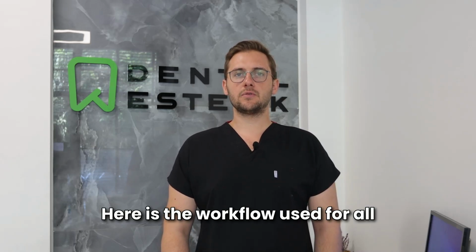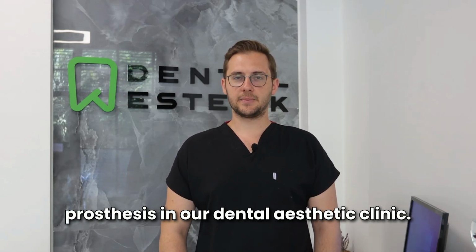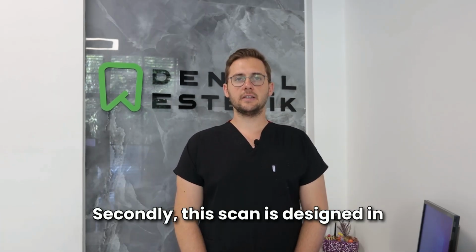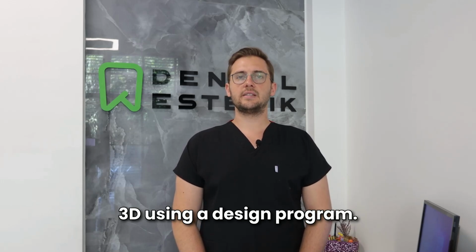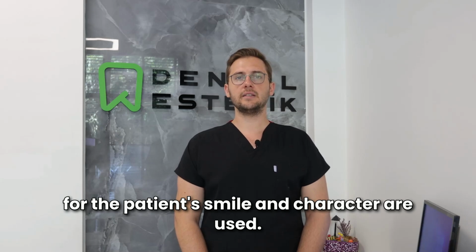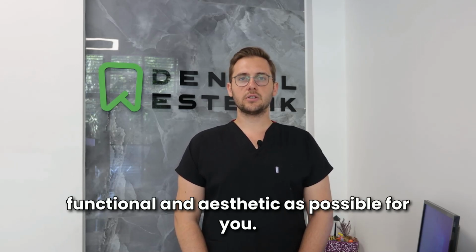Here is the workflow used for all prostheses in our dental aesthetic clinic. First of all, a 3D scan of the prepared teeth is taken. Secondly, this scan is designed in 3D using a design program. In this design, the most suitable tooth types for the patient's smile and character are used. Our goal is to make the prosthesis as functional and aesthetic as possible for you.